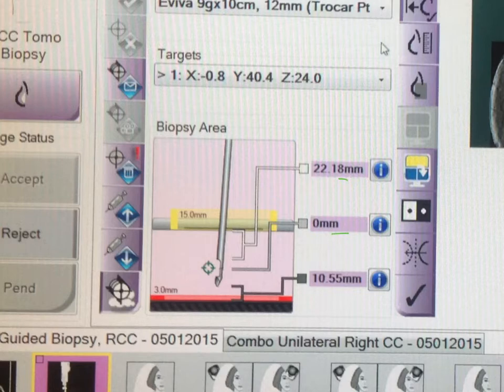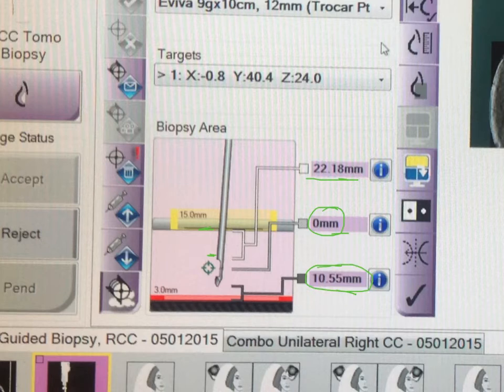This top one here shows us a sufficient depth between the most proximal part of the chamber and the skin surface. The middle one here tells us that this will be when we are correctly at target, so it should be zero. And this bottom figure shows us the distance between the back of the deployed needle and the back of the breast or the image receptor plate here. And again, obviously you want that to be a positive figure. If any of these are shown in red, then that shows that you have inadequate distance either between the device and the skin or the device and the image receptor plate at the back.